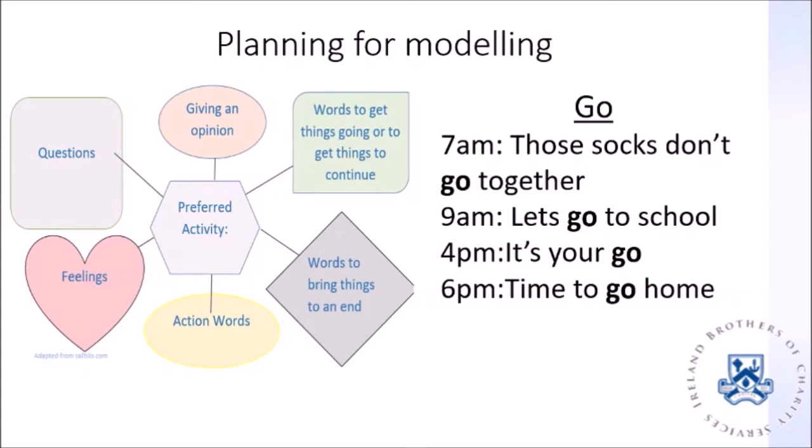Once you have your plan for when and what you want to model, it might be helpful to rehearse what you want to say. Find how to access the words and practice saying sentences and modeling with the device. Remember to try and make sure what you are modeling is interesting, functional, and motivating. If interactions with others involving AAC devices aren't enjoyable, meaningful, powerful, or fun, why would the language learner be motivated to pay attention to it or use it?